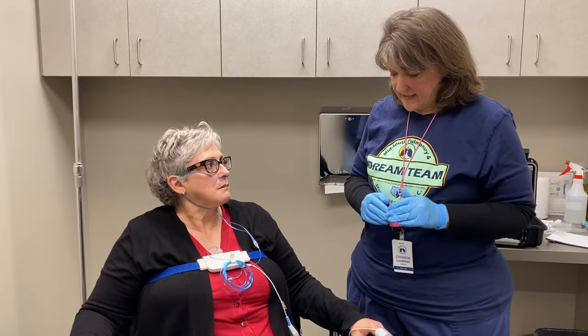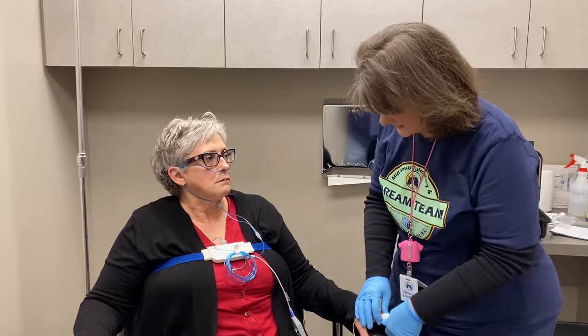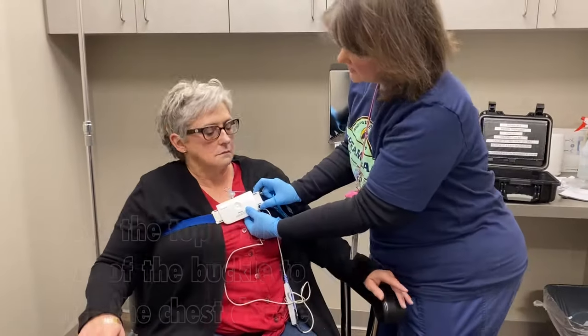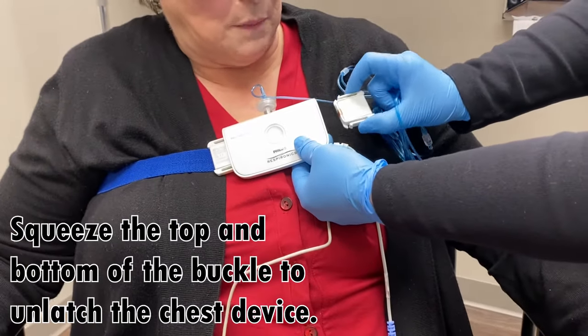When you're ready to get up, you do not have to remove the equipment in any particular order. To get this belt off, just squeeze the top and bottom and it releases out.